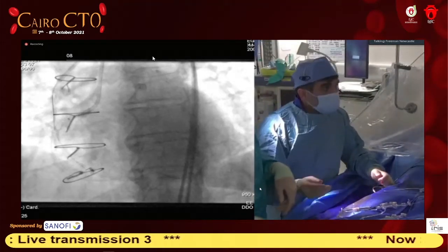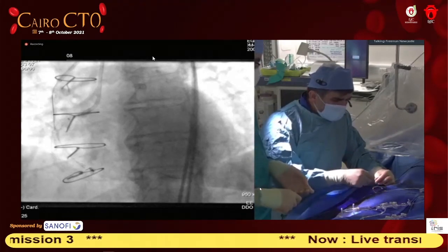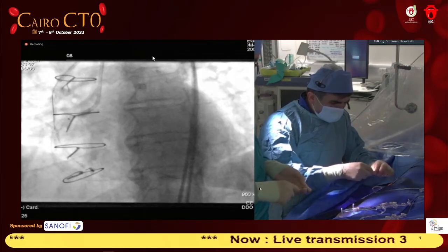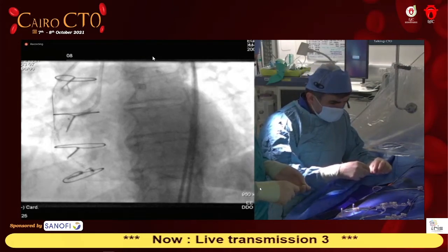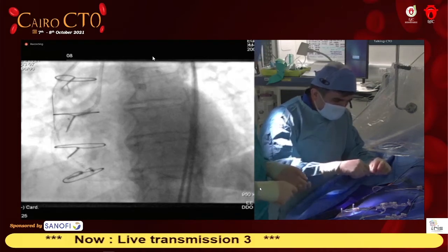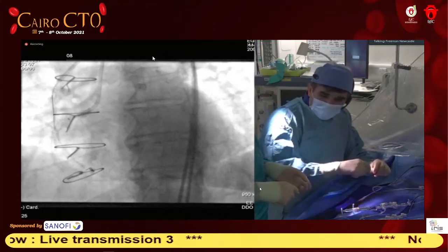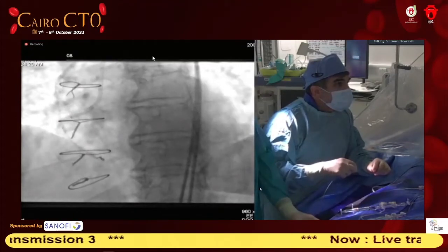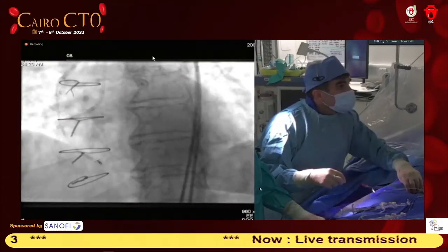Let's have the stilet again. In this case now, because there's a coil sitting there, I could inject this quickly, but I'm not going to do this yet. Maybe the second, third, or fourth one we could inject. What I'm saying is that you wait for at least two coils before you start injections with saline. Yes, absolutely. To be honest, in this case, I might just deliver them all with the stilet. And the flow does not stop immediately, incidentally. Don't expect this.